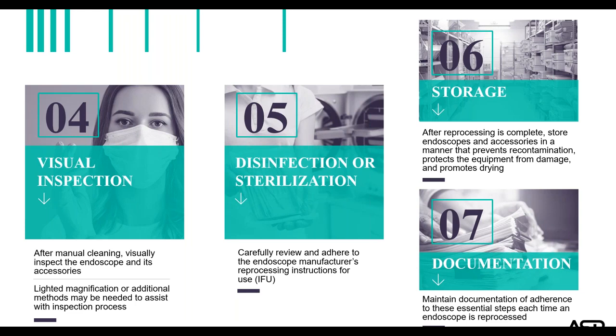There's not a consensus on length of time a flexible endoscope can be stored after high-level disinfection. And it really is dependent on a risk assessment and the professional guideline that the facility is following. It is recommended, however, that the scopes do not touch the floor of the cabinet and that they never be stored in the original shipment case.